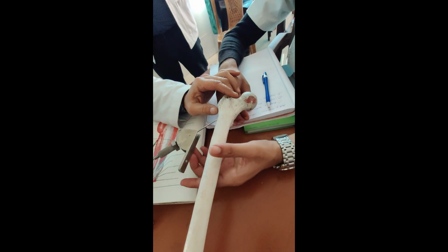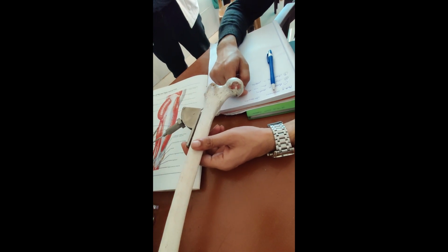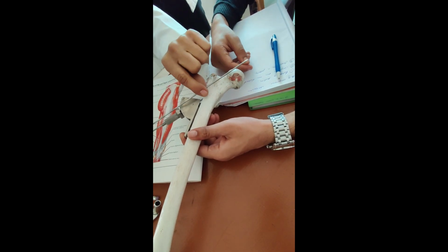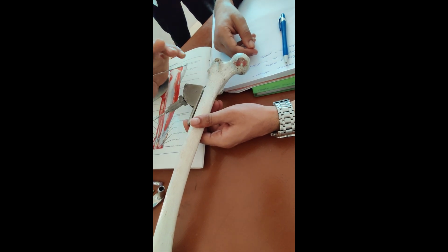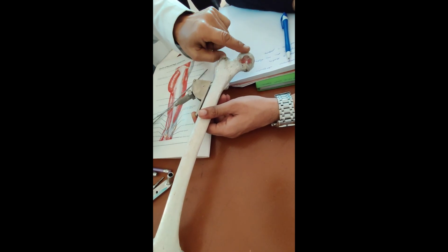Take the AP view. From this you can have a trajectory, whether my axis is going superiorly, inferiorly or central. At least that idea you can have. Or you can mount another guide wire over there to minimize the radiation exposure. I can put a guide wire above and see if my trajectory is going to hit the superior part, the inferior part, or the center. One point is clear: in the AP view, my trajectory is like this.